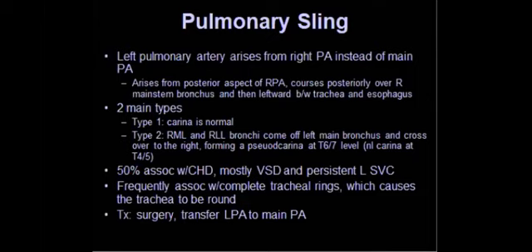Okay. Let's shift to another one. So let's go to our bubbles. Try to find which bubble they are talking about.